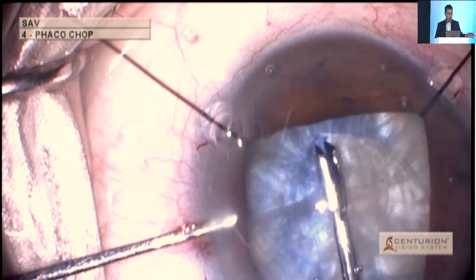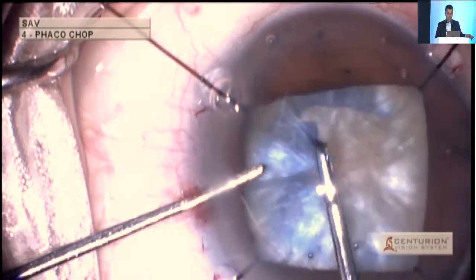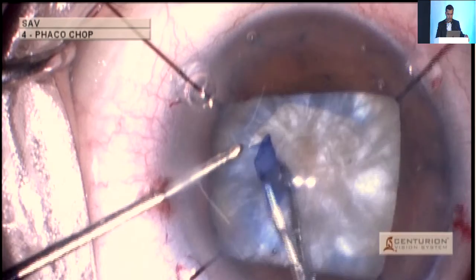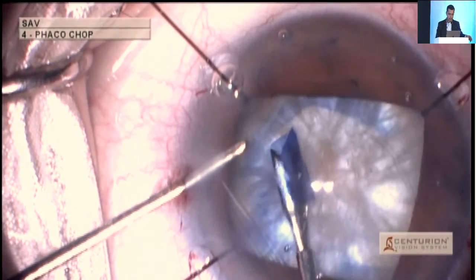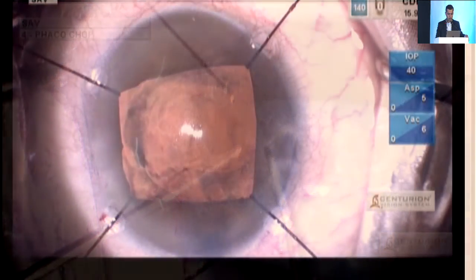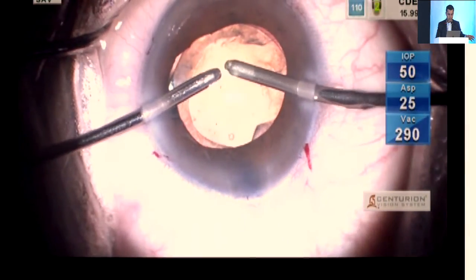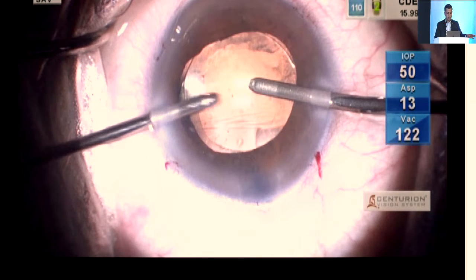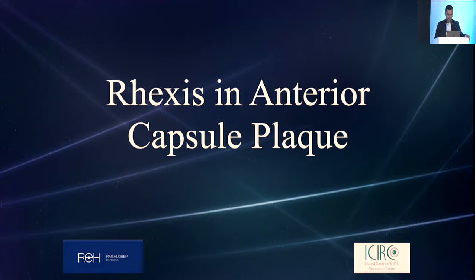The only thing that I want to be careful of is to keep my parameters low when I'm doing a phaco, and I don't want to rush through this because there are lots of open cuts, one here, one on this side, and anything can give way during the surgery. So I was able to complete this into a rounded shape, and I'm just going to go off to show how it looks. There's a split here, if you can see, and there's a split there. But because most of it was rounded, and I've kept my parameters during surgery low, I never inflated the bag, and so I was able to put the lens inside the capsular bag.